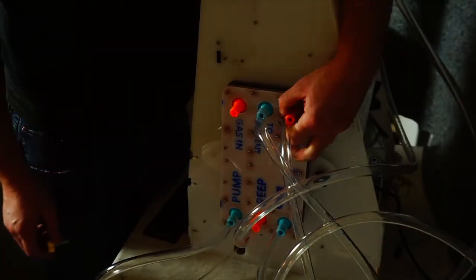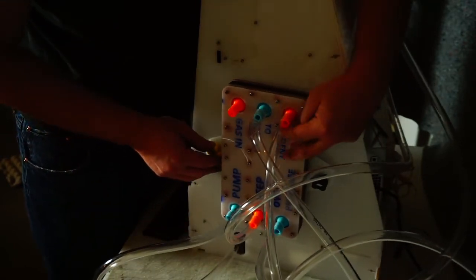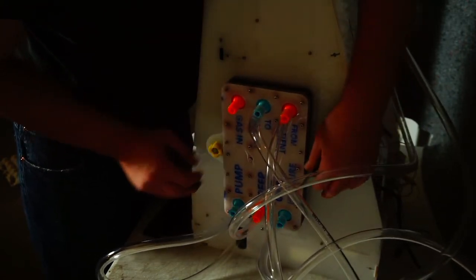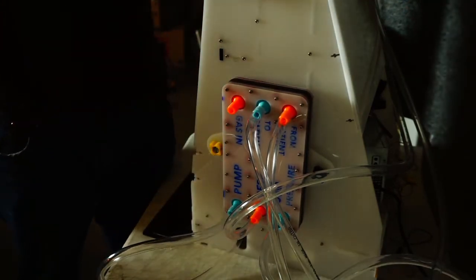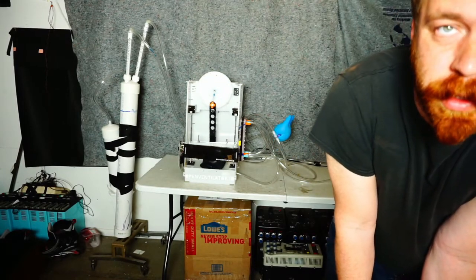So once you have the valve block assembled, there are these two screws which just mount to these two holes in the machine. It's not necessary to mount these into the machine for its functioning, but it's just a nice place to put it to keep it out of the way. And these don't need to be tightened down, they just sit there. Now that it's hooked up, we can turn the machine on. There you can see the valve is working.